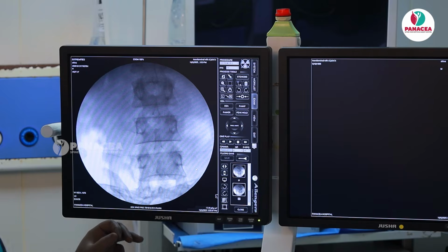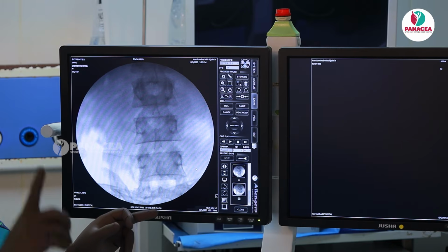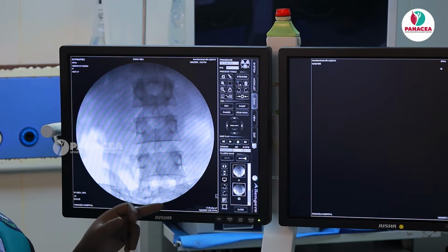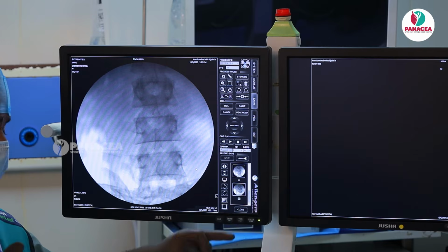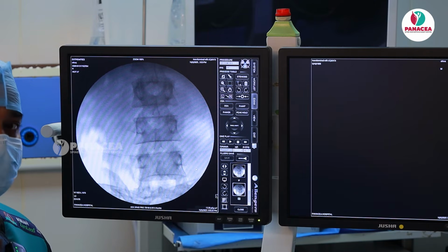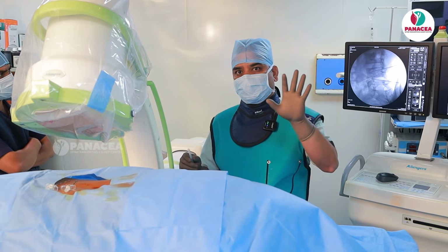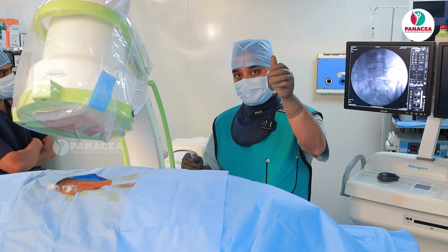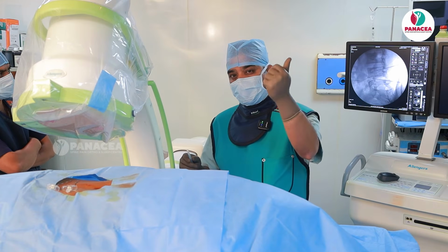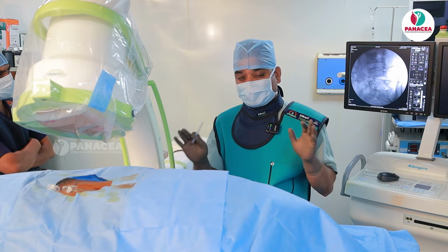And point number 2 is that on the same, ipsilateral side, the tip of the SAP should stand exactly below the 6 o'clock of the upper pedicle. These are the end points for obliquity. So it all depends. As you go to higher levels like L1-2, L2-3, L3-4, the requirement of obliquity will be reduced. That is the first point. For transforaminal fluoroscopy we require an AP shot, oblique and lateral. This is oblique. We have placed almost 30 degrees.